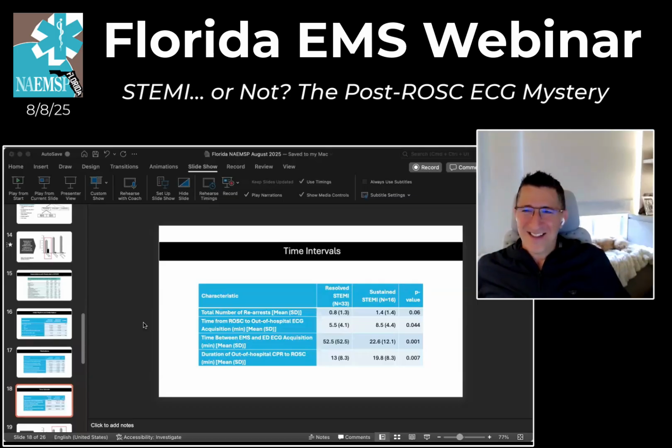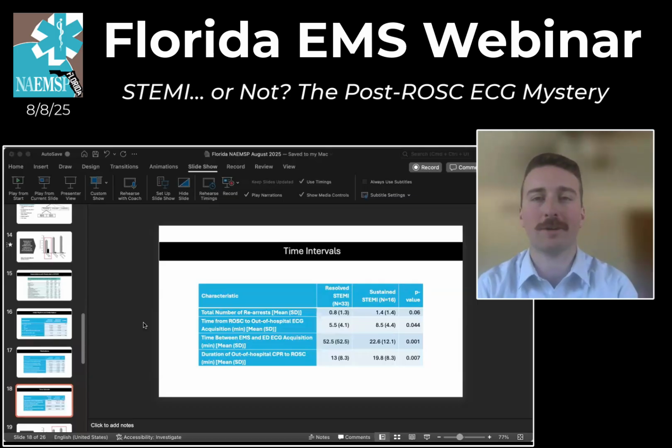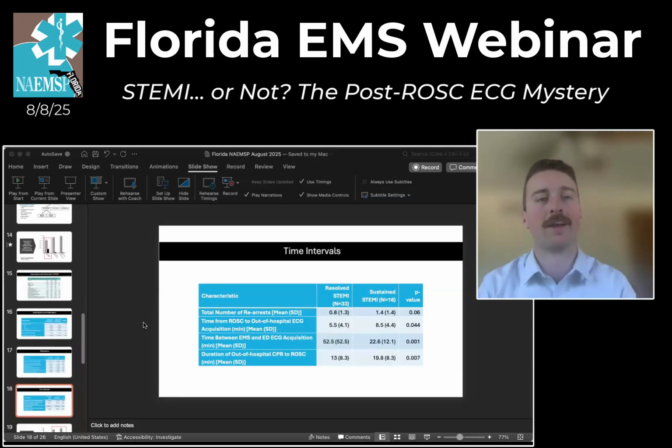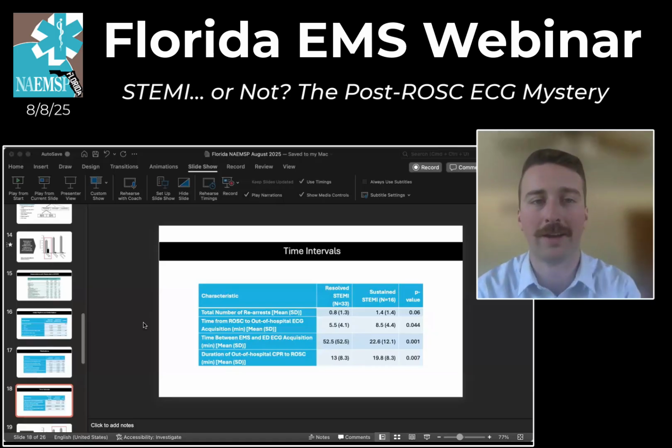Go ahead, Chris. I think that's a great point because certainly there's non-ischemic causes of cardiac arrest that we need to identify and quickly recognize in order to guide our management. So, looking at ischemia in the context of resuscitated arrest, maybe that's where that role for serial 12 leads really comes in, encouraging EMS crews to be getting repeat EKGs, see how that is dynamically changing or not in the duration of their care, especially if you have lengthier transport times and are going to be with that patient for a while. But I think that's a great point.